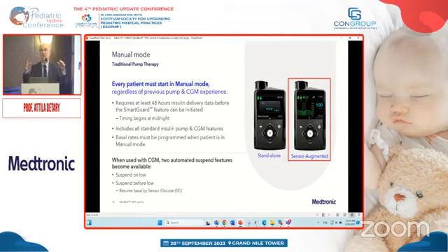And you remember the total daily dose on the pump, which was 40 in our example. And we have different formulas, 500, 400, 300 divided by the total daily dose. So for example, for an adolescent, we usually use the 500 formula. 500 divided by 40, it's around 12.5, so 13, meaning that one unit of insulin covers for this individual around 13 grams of carbohydrate.